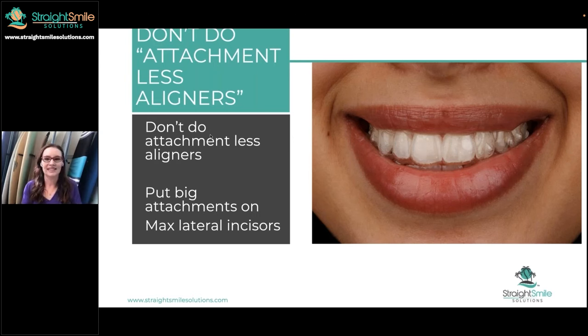If you really have to do attachment-less aligners, personally I wouldn't use Invisalign because their trim and their material is really, really soft. For example, this is ClearCorrect — it's pretty rigid. It's hard to bend. But this is Invisalign — you can't do that with ClearCorrect. On the Pro, the trim line is low, it's comfortable, it's good for perio. But the con is it's not good for attachment-less aligners. I would use ClearCorrect or Reveal.